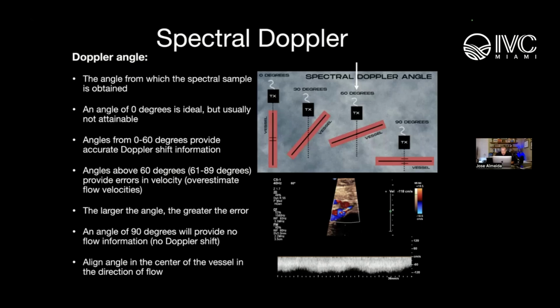These are the basics. We'll probably need to do a whole different podcast on deep imaging, because what went into that image was a lot of experience. Okay, so again, just to reiterate, 60-degree angle, and you can get an idea here of the vessel.